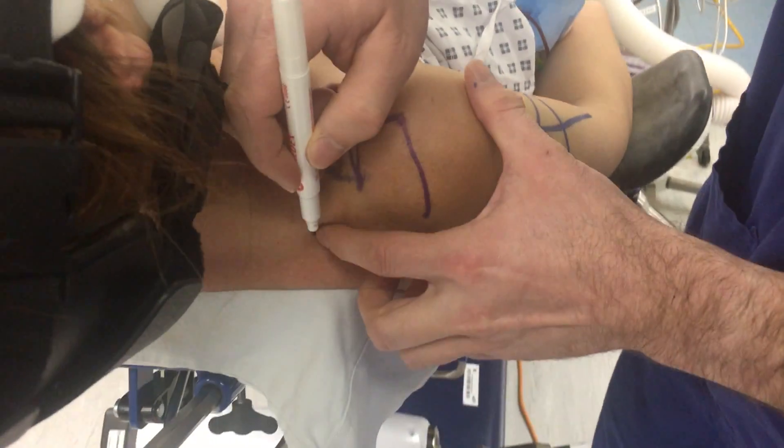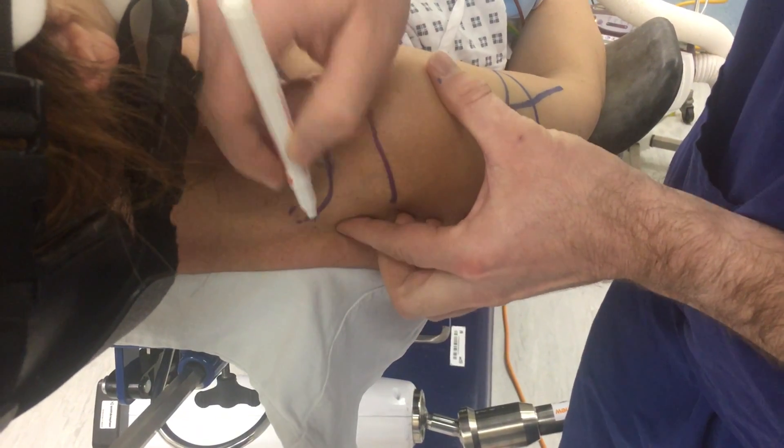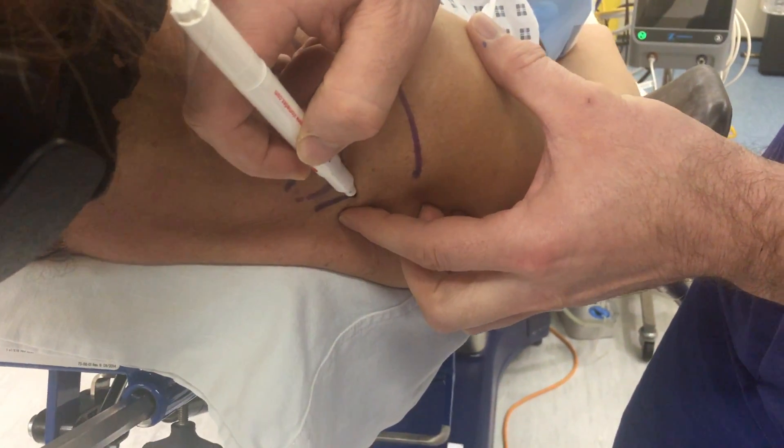You can then follow the acromion back onto the spine and the posterior aspects of the spine across to your posterolateral corner.